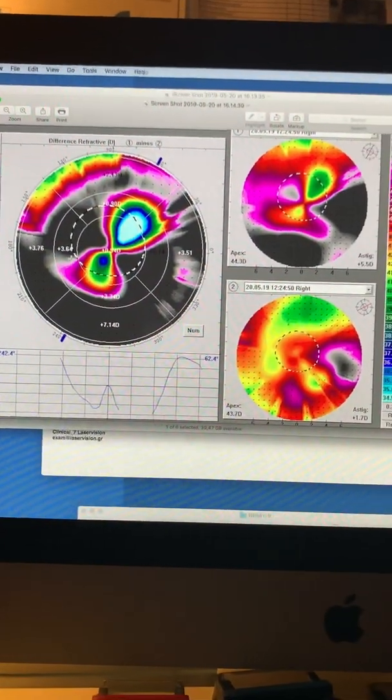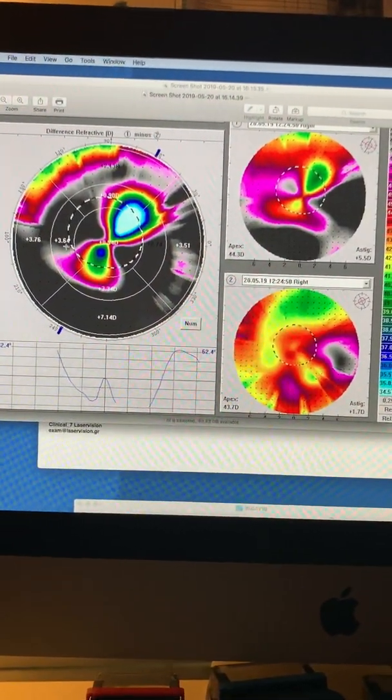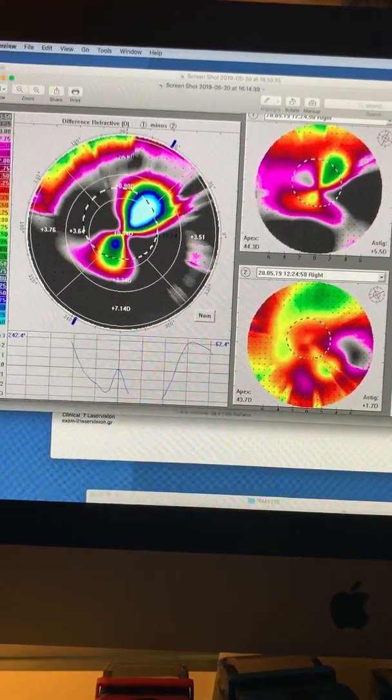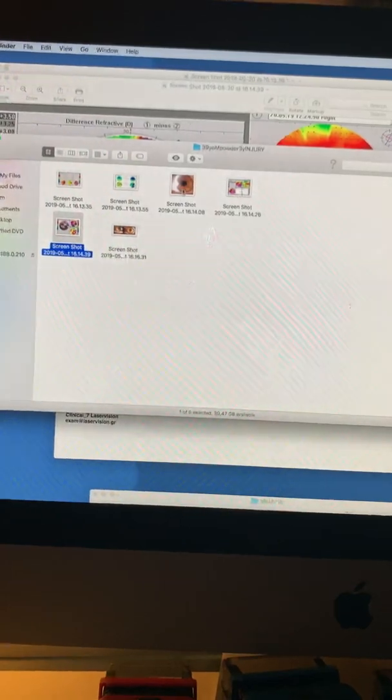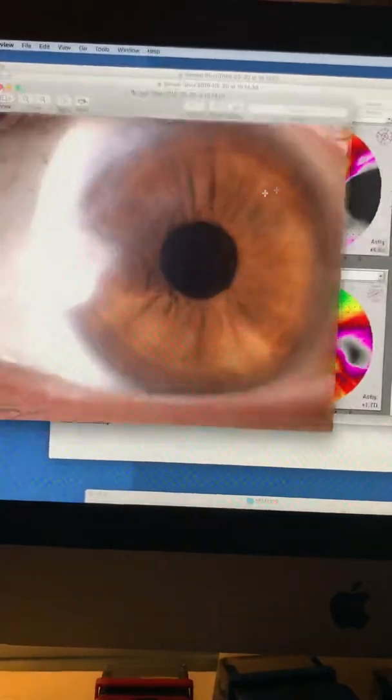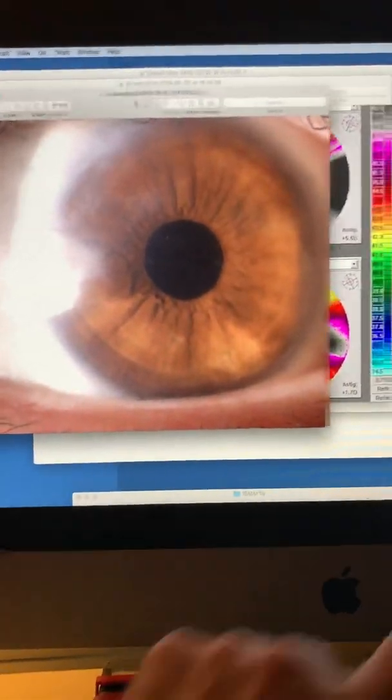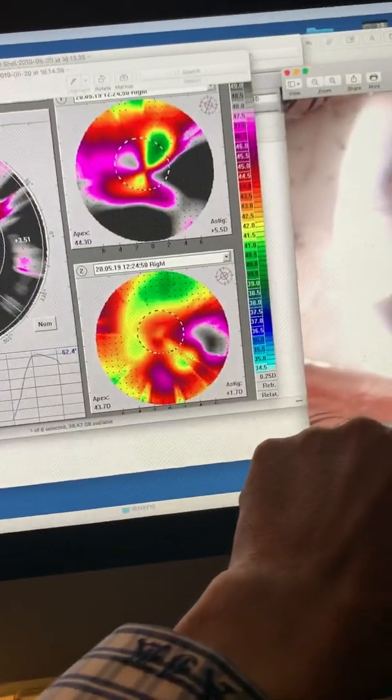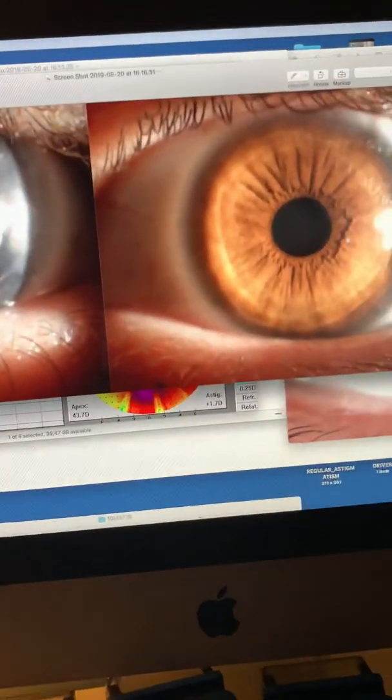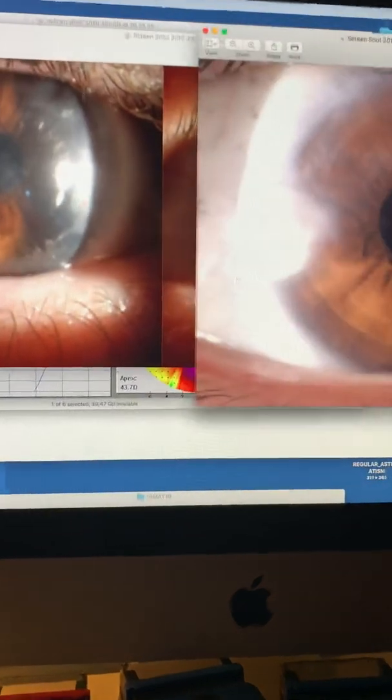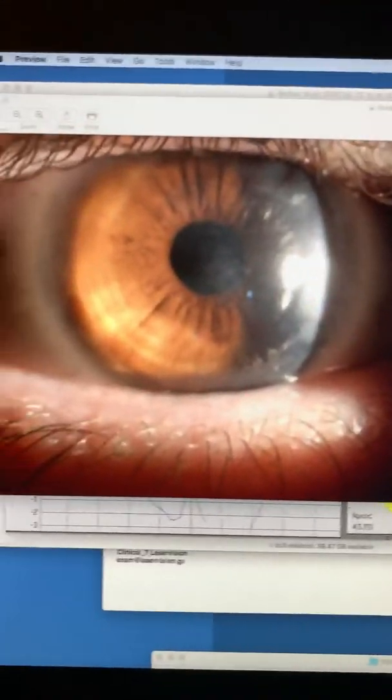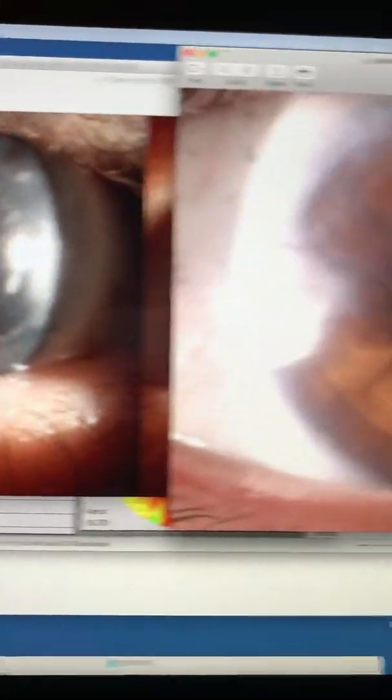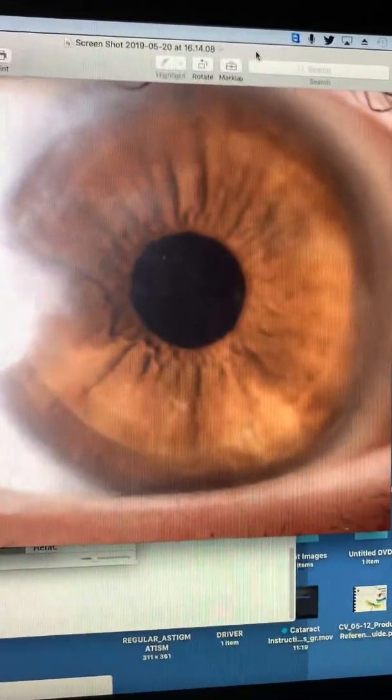We're going to look at the corneal clarity now and put it right next to the pre-op. This is the corneal clarity now. And if we click on the pre-op, we'll see how it used to be and how it is today.